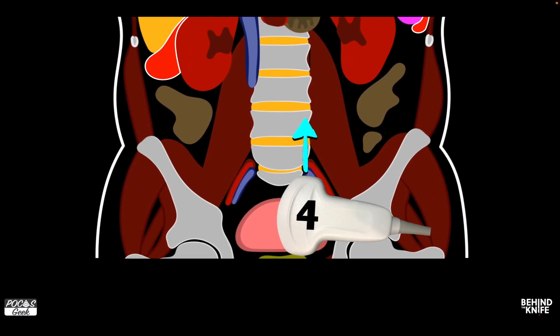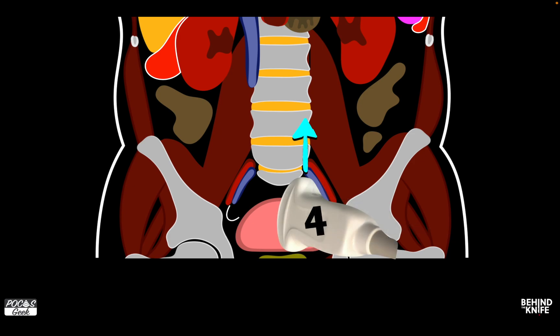Moving on, we're going to evaluate the lower abdomen by placing the probe in the midline with the probe marker towards the patient's head, just superior to the pubic bone. We do want to identify the bladder, but we need to keep in mind that the bladder is a pelvic structure, and so we actually want to see fluid superior to the bladder in the intraperitoneal space.